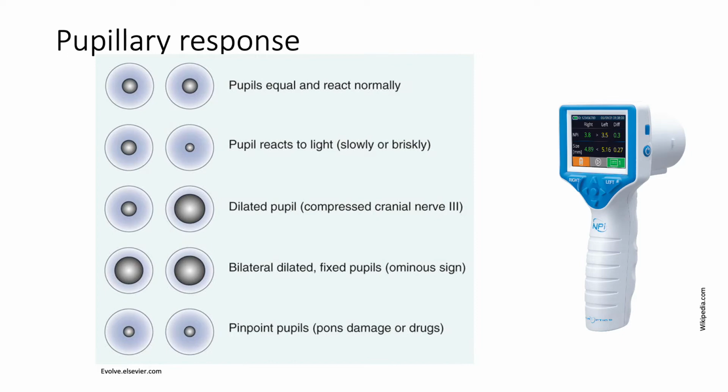Pupillometers scan the patient's eyes and provide an objective measure of pupil size as well as reaction. So think about it. This can mean the difference between thinking a patient has fixed and dilated pupils or just sluggish pupils, which can really weigh heavily on our patients' plans of care.